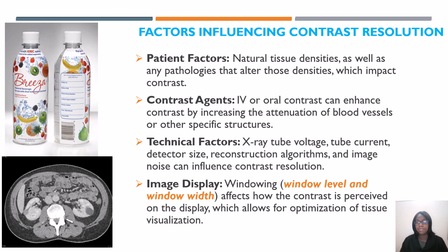After they drink the contrast, they may have to wait an hour or so before you can scan them. So just keep that in mind whenever you do have to hand the patient oral contrast. And then you also have technical factors. You have your X-ray tube voltage, your tube current, detector size, reconstruction algorithms, and image noise that can influence contrast resolution. You also have image display, windowing, your windowing level, and your windowing width. This can affect how the contrast is perceived.